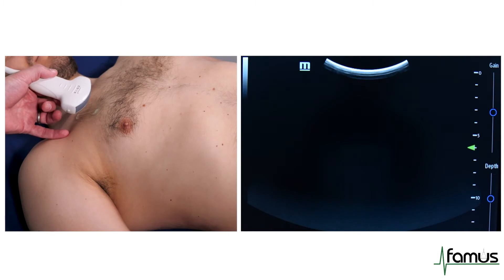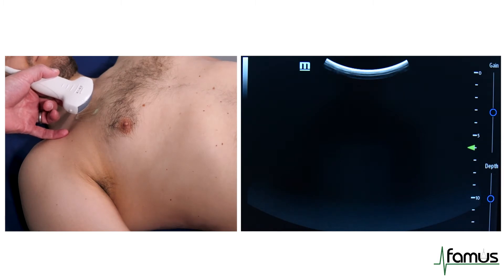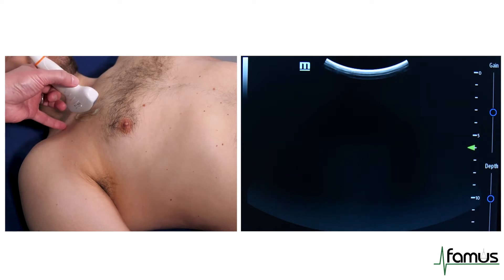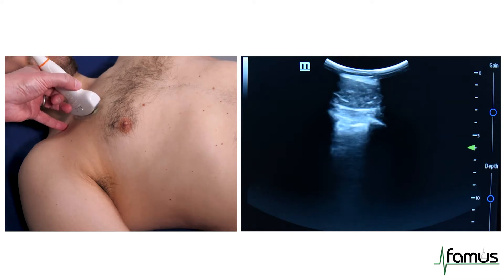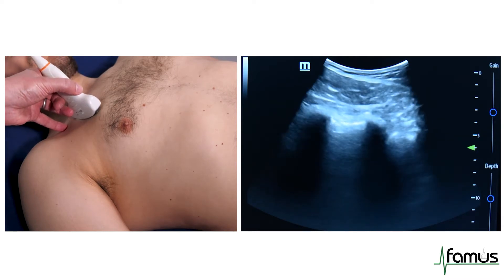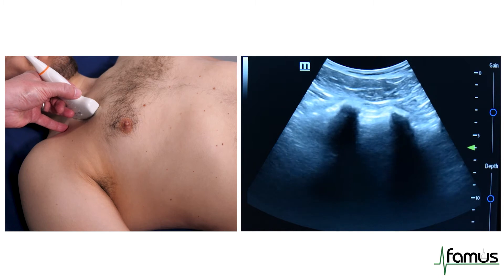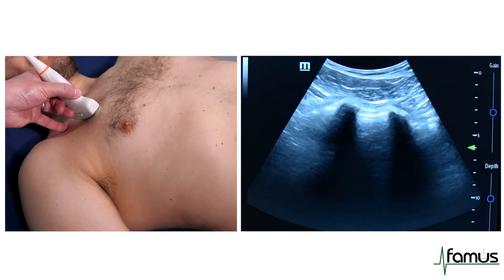For this examination we're going to hold the probe in a longitudinal plane with the dot pointing up towards the patient's head. You'll see that I'm going to fix my scanning hand to the patient's torso to prevent any movement of the probe.